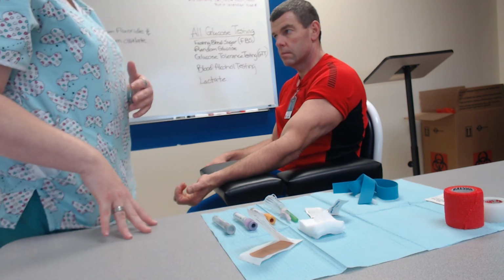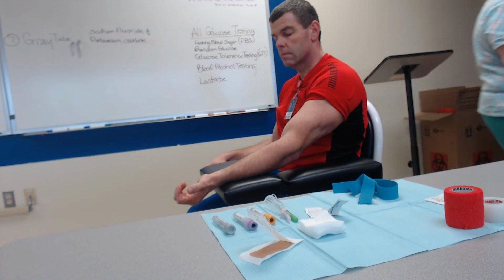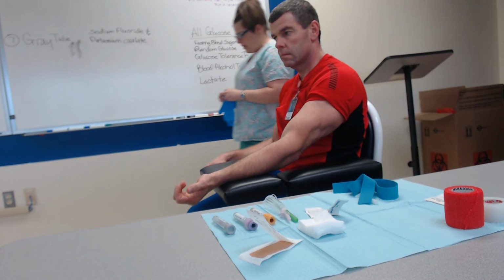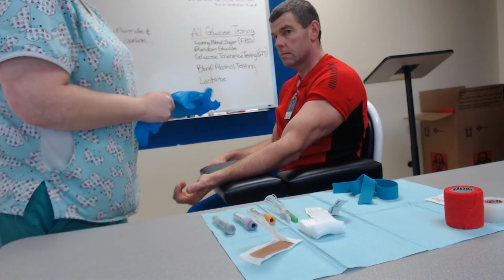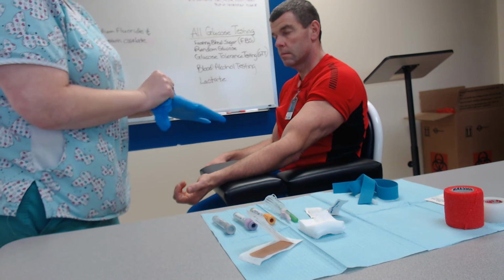By the time you get that set up and you get your gloves and put those on, your patient's arm should be dry, and you can go ahead and reapply your tourniquet and perform your venipuncture.